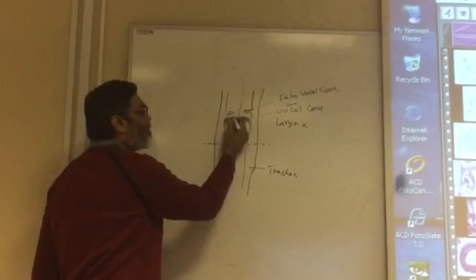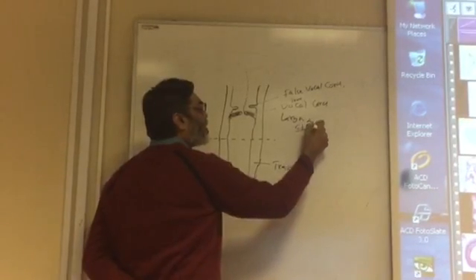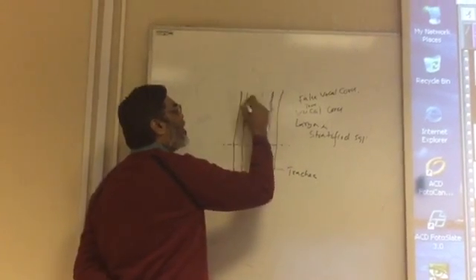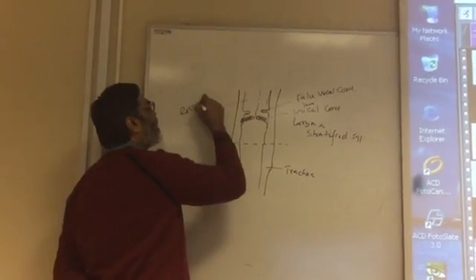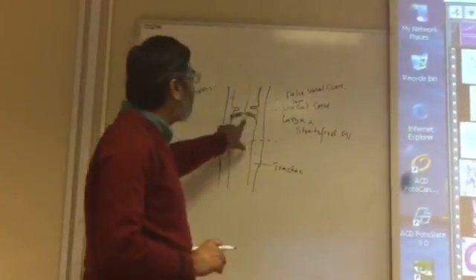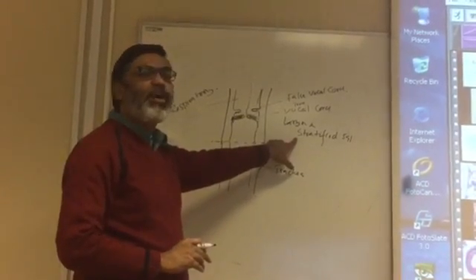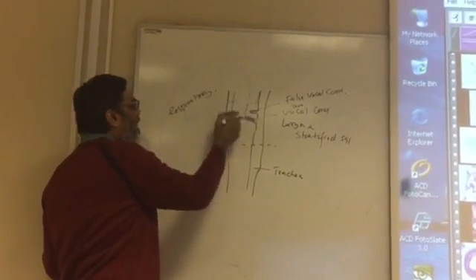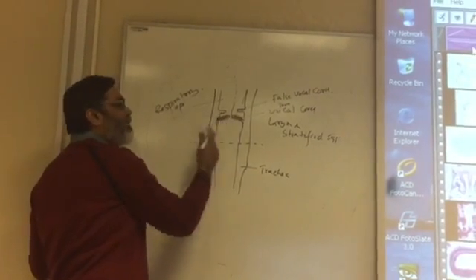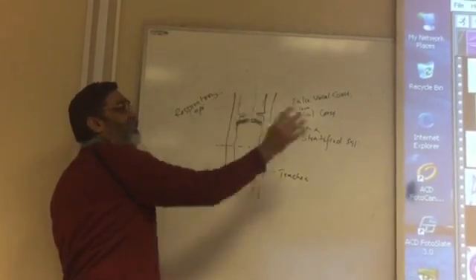And the epithelium of the true vocal folds is stratified squamous. While the rest of the respiratory system is respiratory epithelium: pseudo-stratified columnar ciliated epithelium. So these vocal folds are different from the rest of the larynx by means of epithelium, which is what? Stratified squamous. And the rest of the epithelium is respiratory epithelium. And then they have skeletal muscle present here, which controls their movement. That's the only difference. The rest of the structure is the same, like the trachea.